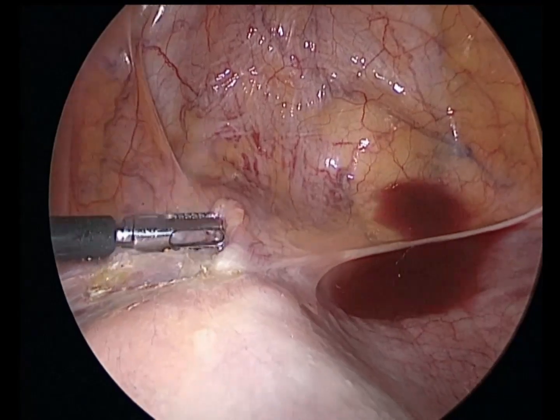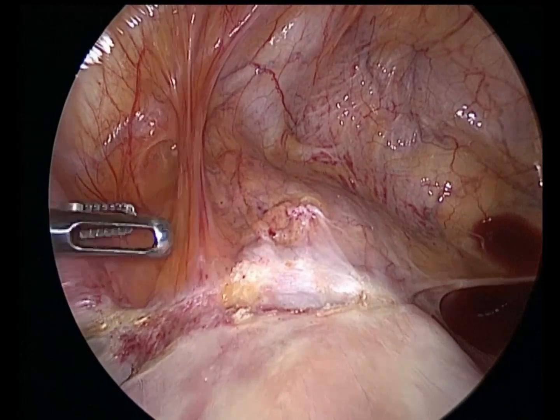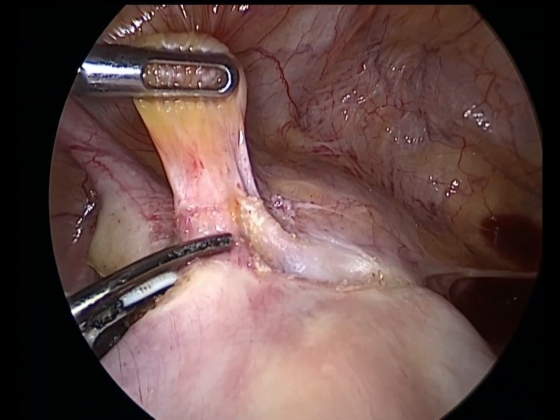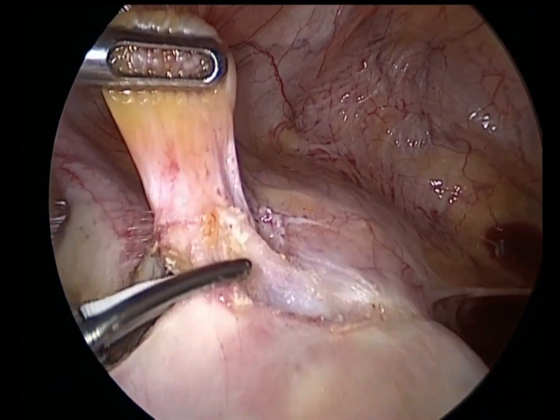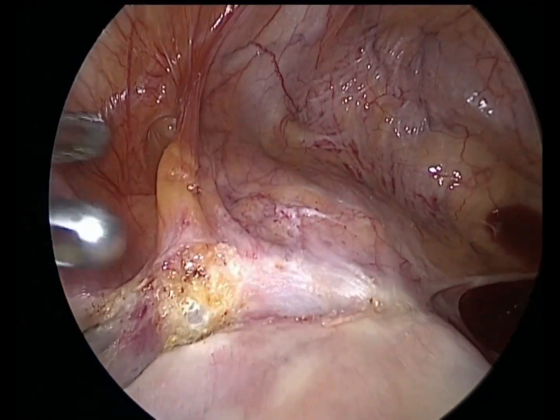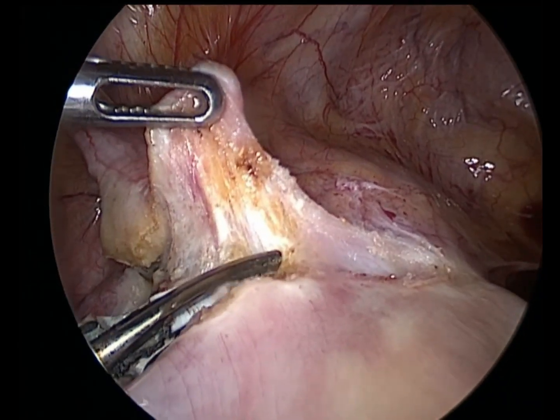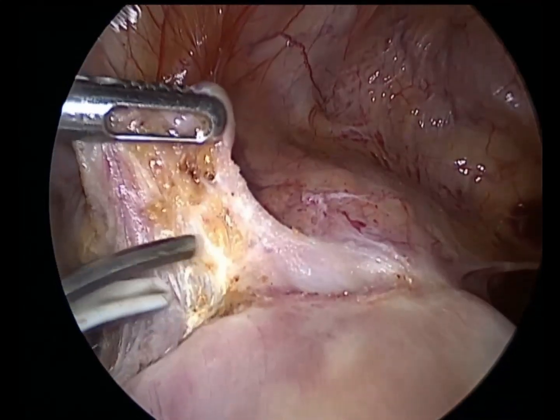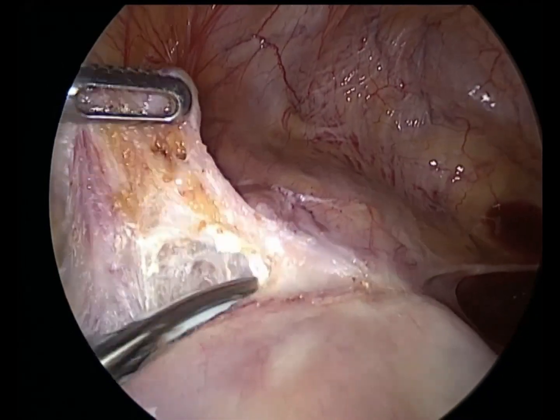You have to give good traction and counter traction to separate the bladder. And second thing is, if there is bleeding, don't unnecessarily keep on coagulating the bleeder. Just put a gauze piece. These bleeders are weak bleeders and they stop by the pressure of a gauze piece. By the time you finish your surgery, the bleeding has already stopped. If you keep on coagulating the bleeder, you will end up with a bladder injury.